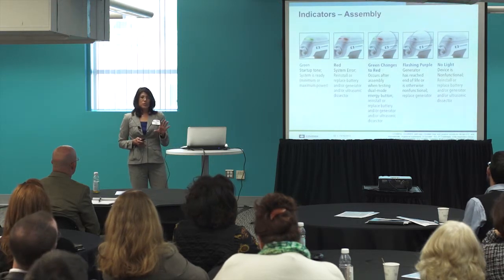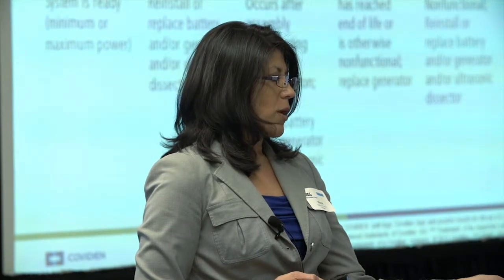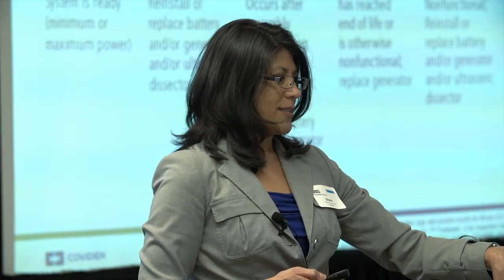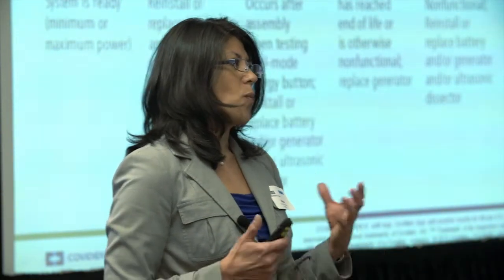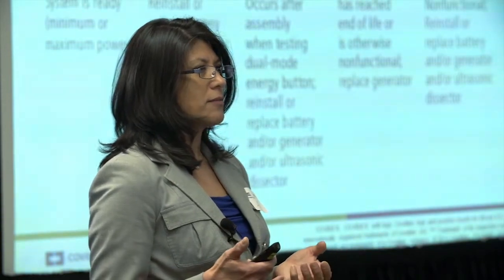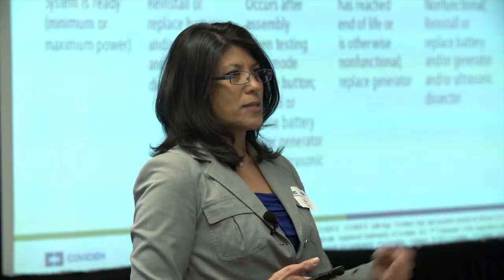So with the reusable components, we had to also indicate end of life. For the generator itself, we originally wanted to have a white indicator that would be distinct from some of the other indicators that we had. However, technologically, we had a little bit of problem with the software, and we couldn't get a true white to show up. And the lighting conditions within the OR environment give a little bit different perspective of what that color could be. So what we ended up doing was just asking the users, what color does this represent?